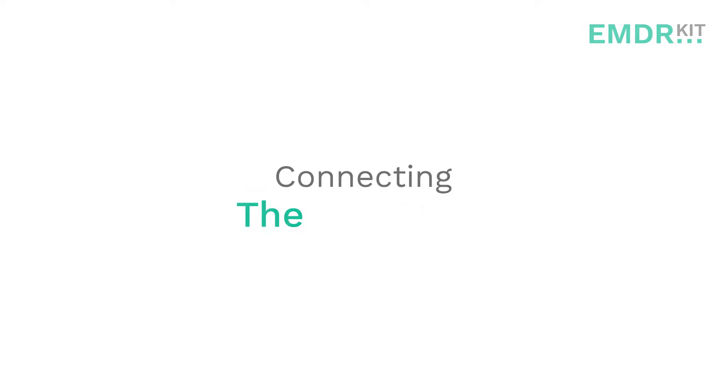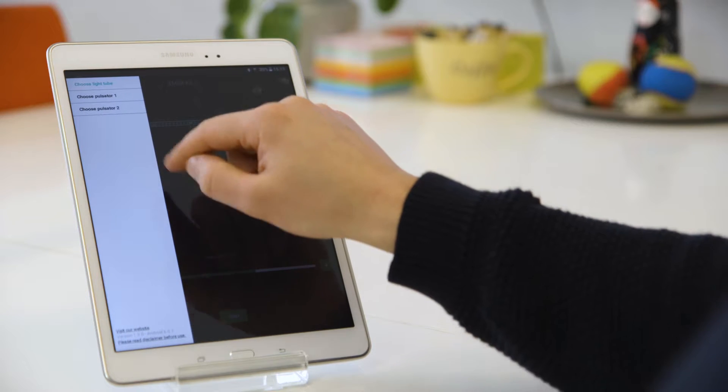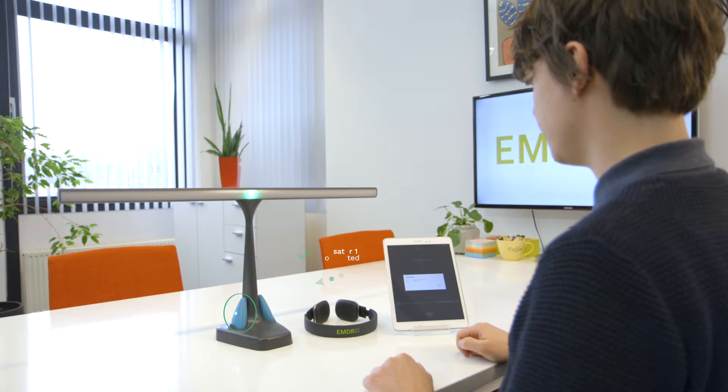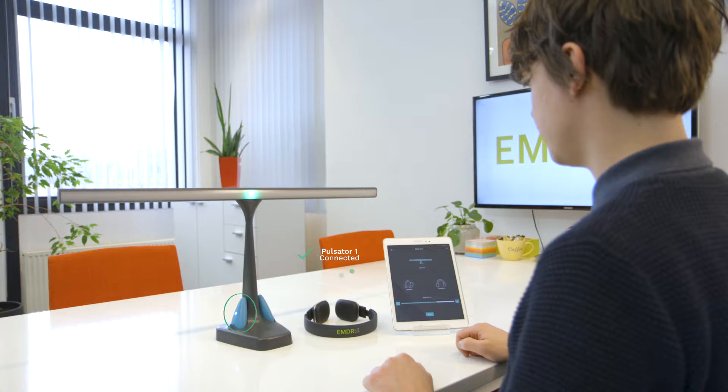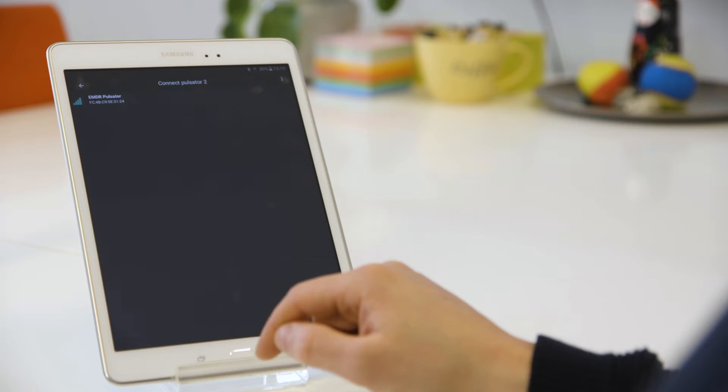Connecting the pulsators. Open the top left menu and click Choose Pulsator 1. Now select the pulsator with the strongest Bluetooth signal, as indicated by the green bars. Repeat for Pulsator 2. The pulsators will turn on and be ready for use.